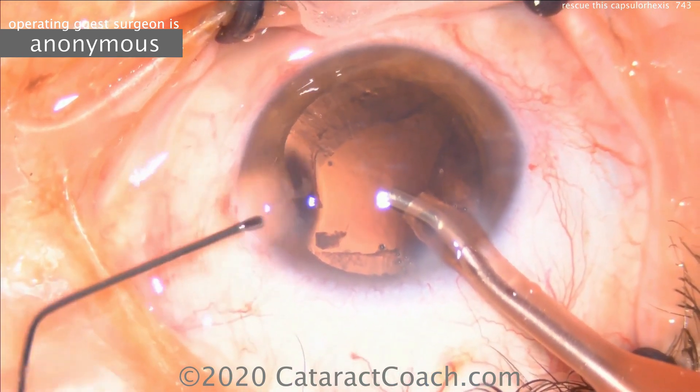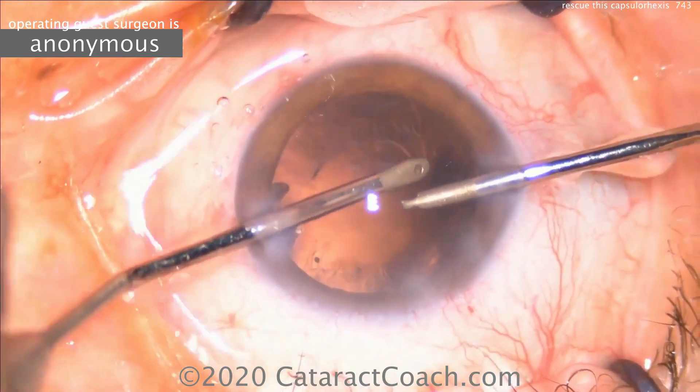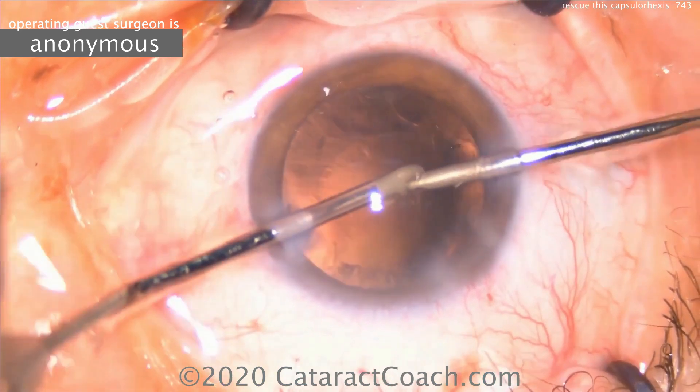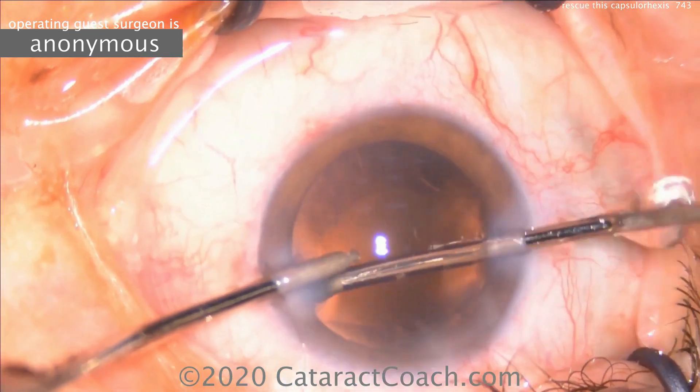A very smart move: keeping the phaco probe in the eye in position one, and now using viscoelastic with the other hand to fill it up. Beautiful technique. Now, by manual irrigation-aspiration, remove the lens cortex, and that proceeds normally.